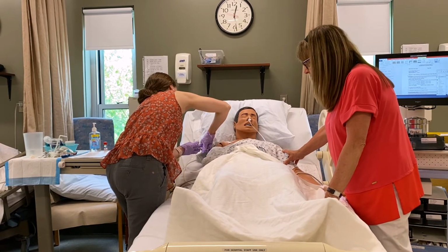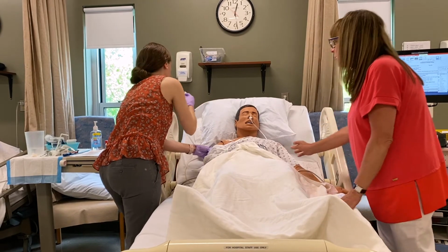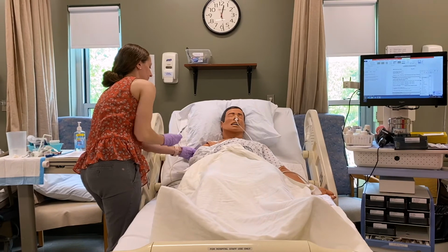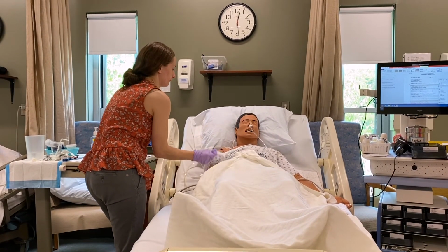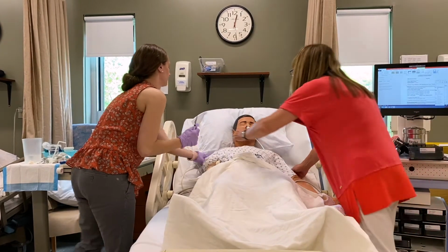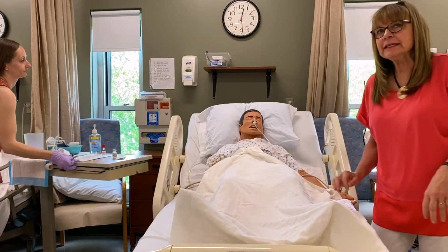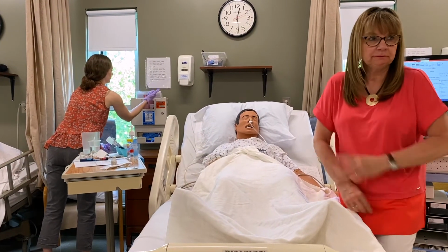No aspiration for a vaccine, correct. Yep. Needle cover on. Great. If you're doing vaccines in a clinic, they make you put a Band-Aid over it.